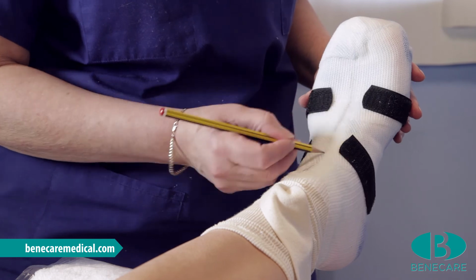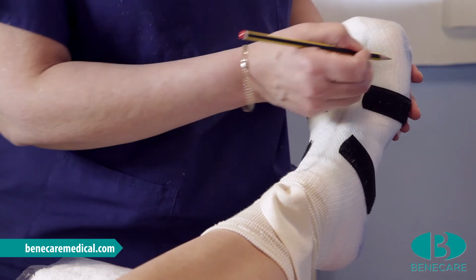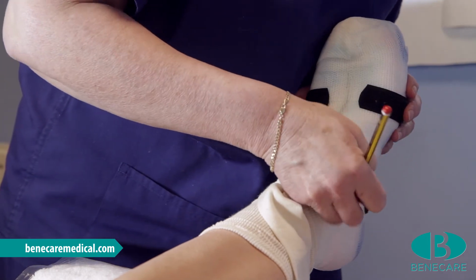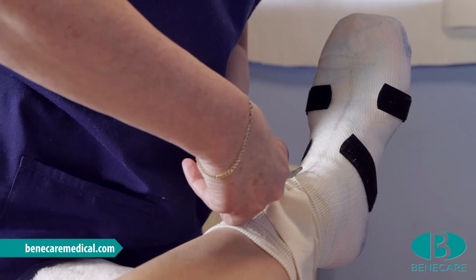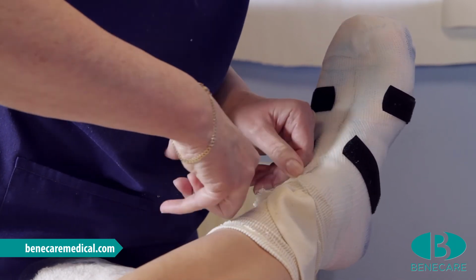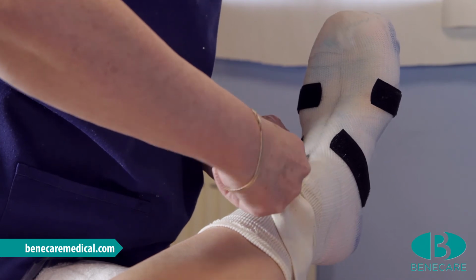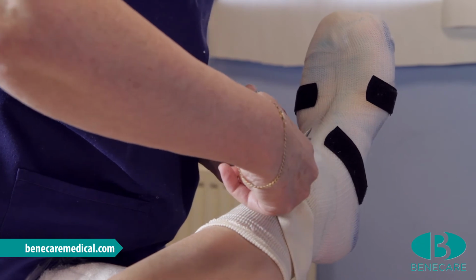Using a pencil, I will mark the cast along the dorsum of the foot, around the toes, under the malleoli, and around the posterior aspect of the heel. Using surgical wire cutters, I will now remove the cast cutting along the dorsum of the foot, ensuring the blade is parallel to the limb, cutting through the third piece of stockinette and the Benecast flex. The second piece of stockinette should be providing protection to the limb during this process.